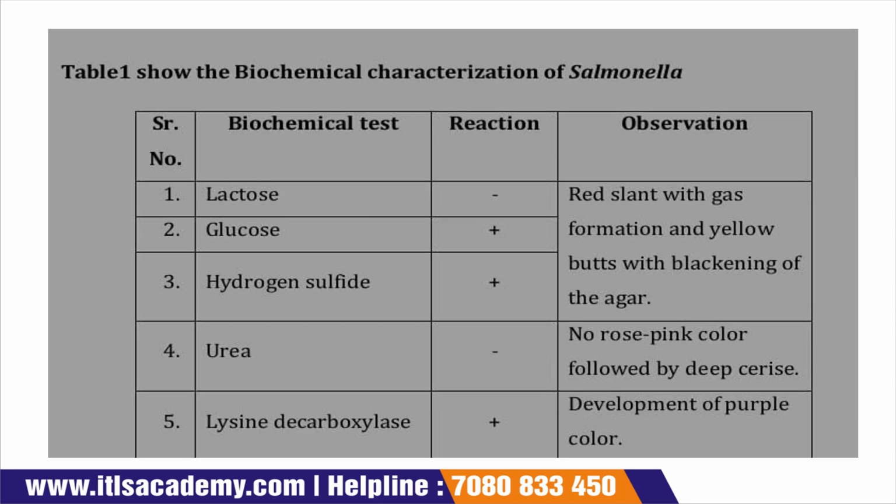So this is a diagram which shows a biochemical characterization of Salmonella: lactose, glucose, hydrogen sulfide, urea, and lysine decarboxylase reaction. Okay, so Salmonella gives a negative lactose test, positive glucose test, positive hydrogen sulfide test, negative urea test, and positive lysine decarboxylase test.